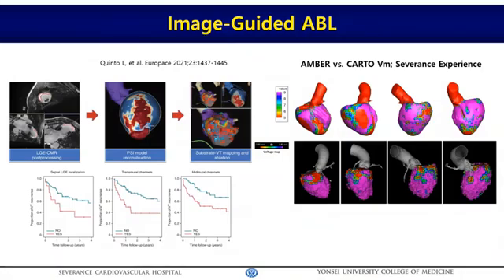Recently, MRI scar or CT wall thickness guided substrate ablation was suggested for high-risk patients. No electroanatomical map, no VT induction, but just substrate and imaging-based ablation. This is a CT wall thickness map and electroanatomical map acquired from a patient with non-ischemic VT, which we ablated 3 weeks ago, except for the artifact on the diaphragmatic attach area. Thickness and voltage map show some similarity.